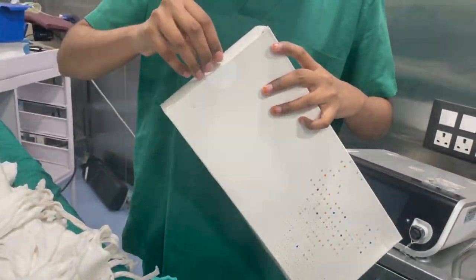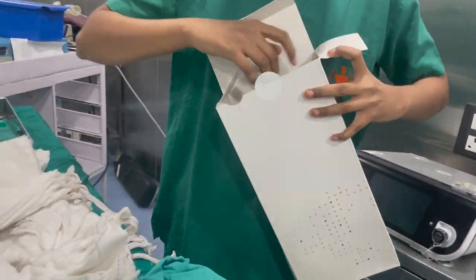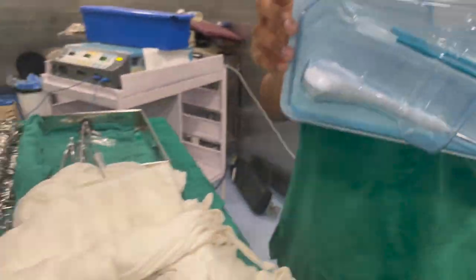When you open this box there is a nicely packed system. You can see there is a needle and a tape.